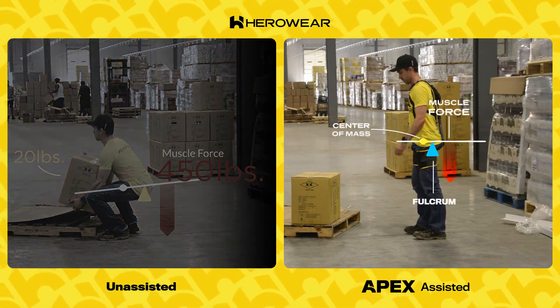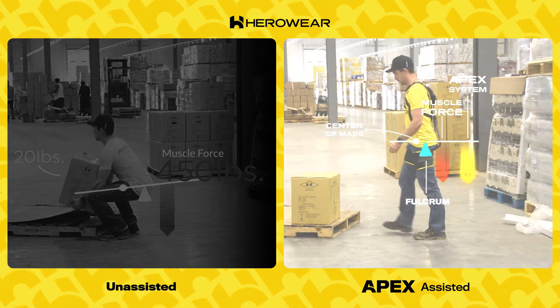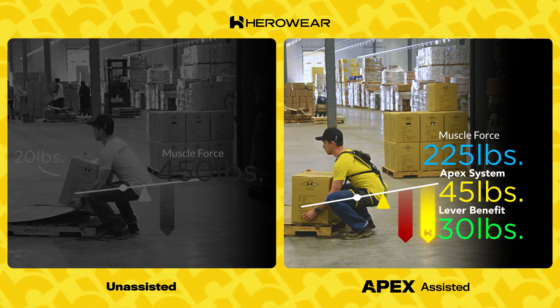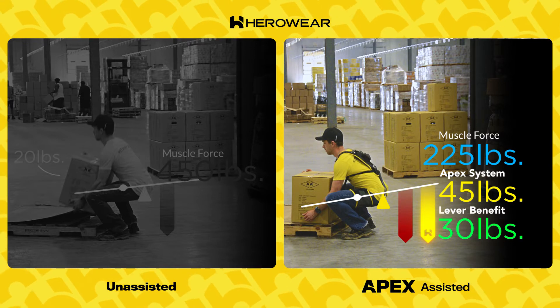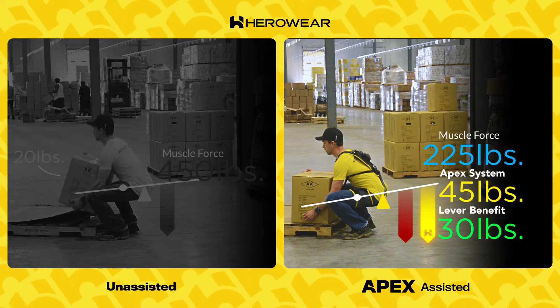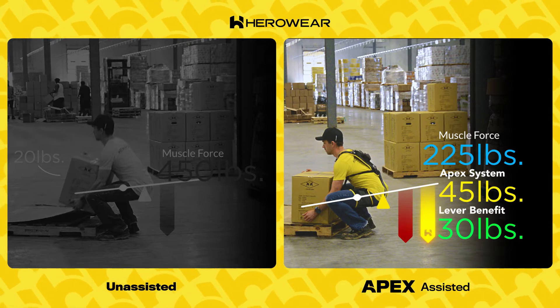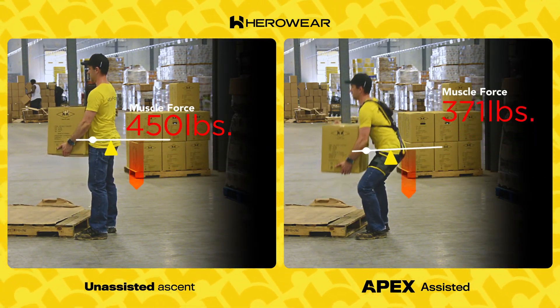With the Apex ExoSuit from HeroWear, there is now a force being applied in the same direction as his back muscles, but further out from his spine — which, remember, is the fulcrum in this lever system. The further the force is from the fulcrum, the more leverage he has to make lifting easier. That means the same object can be lifted with less strain on back muscles and less compression force on spinal discs. He saves about 30 pounds of force just from the way the lever system works.